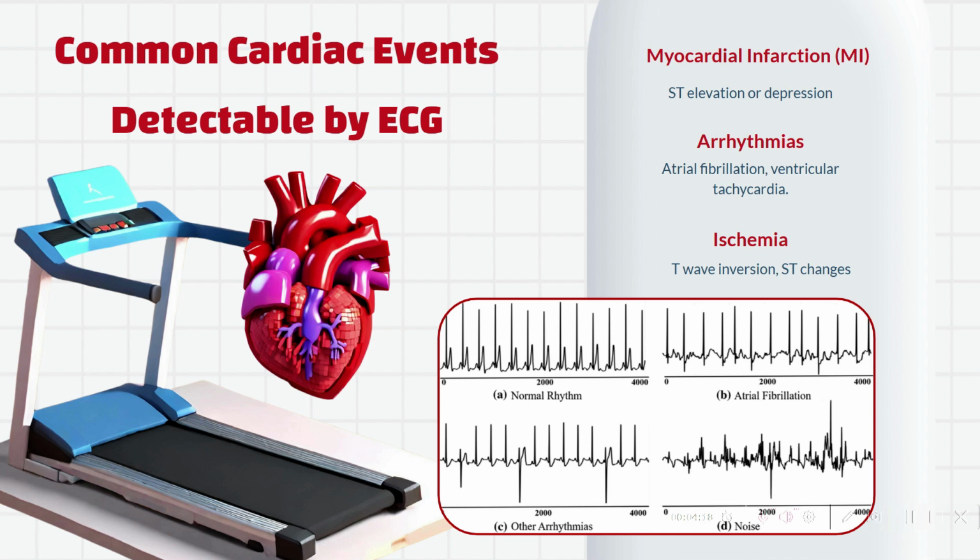Conversely, the ST segment depression or T-wave inversion may signify a non-ST elevation myocardial infarction, which would be an NSTEMI, or myocardial ischemia, where there is partial blockage or reduced blood flow without complete arterial occlusion. These patterns help clinicians quickly diagnose and determine the severity and timing of the cardiac event, which is critical for initiating appropriate treatment.